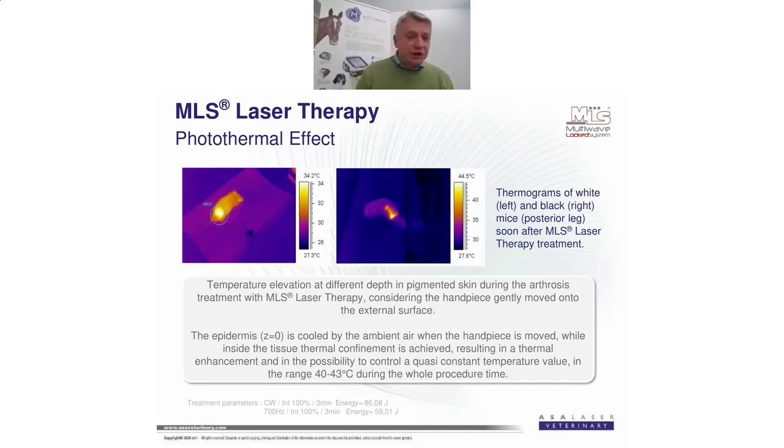So you don't need to do a fast scanning, although you can, in order to avoid thermal damage, but you can do the treatment with a slower scanning or by staying steady in the area, which is the great benefit of MLS.